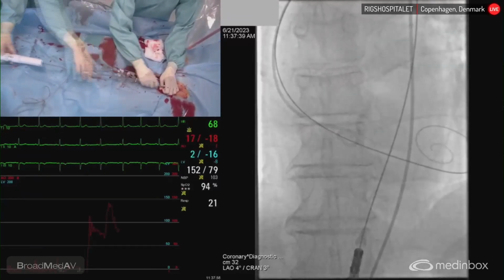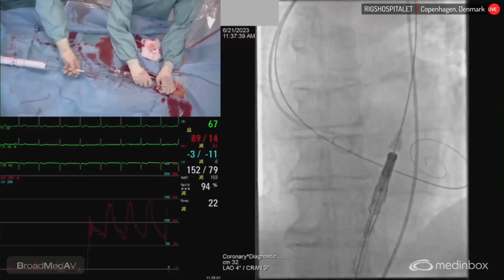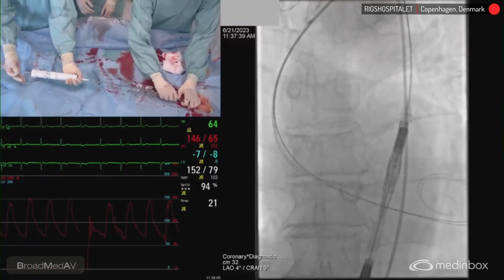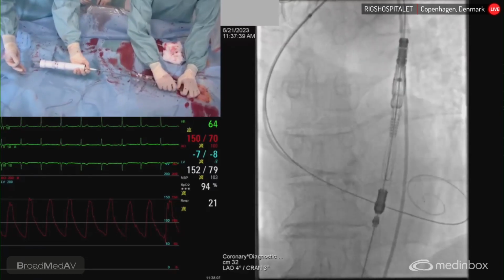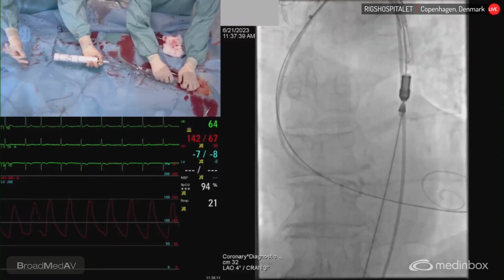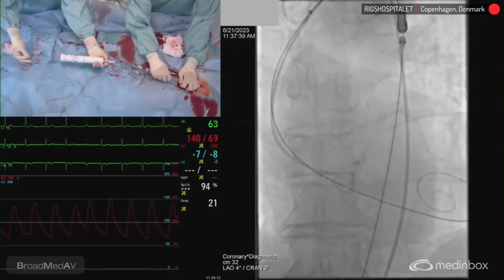Okay, loader back. We can park the loader there. Okay, slowly, guys. Yeah, pressure is there. You can cross the arch and then I will take over. Yeah, enable auto. Because the placement is a bit more tricky, we'll have to be very careful.